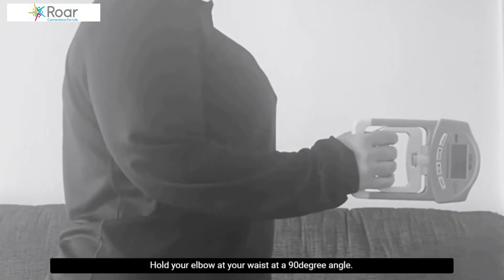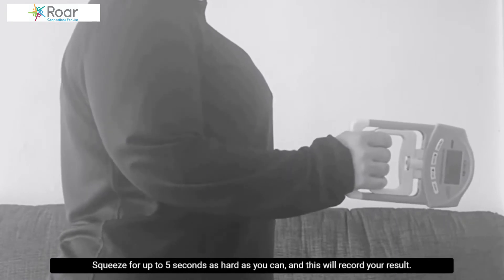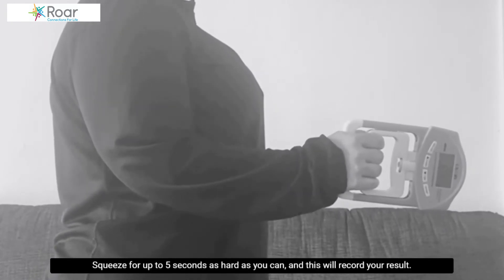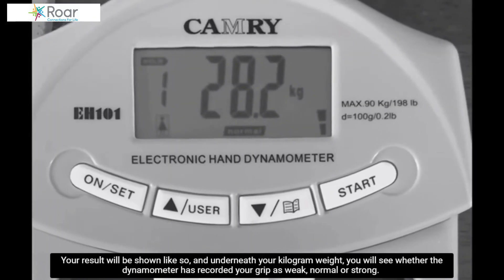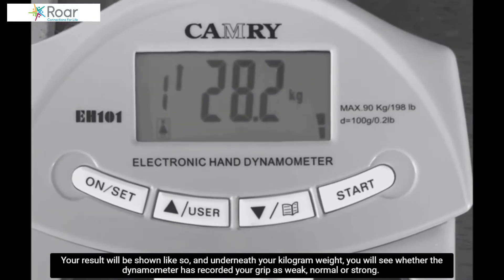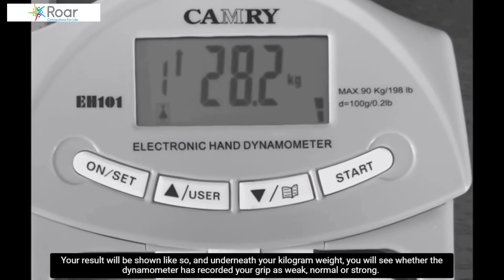Hold your elbow at your waist at a 90 degree angle. Squeeze for up to 5 seconds as hard as you can and this will record your result. Your result will be shown and underneath your kilogram weight, you will see whether the dynamometer has recorded your grip as weak, normal, or strong.